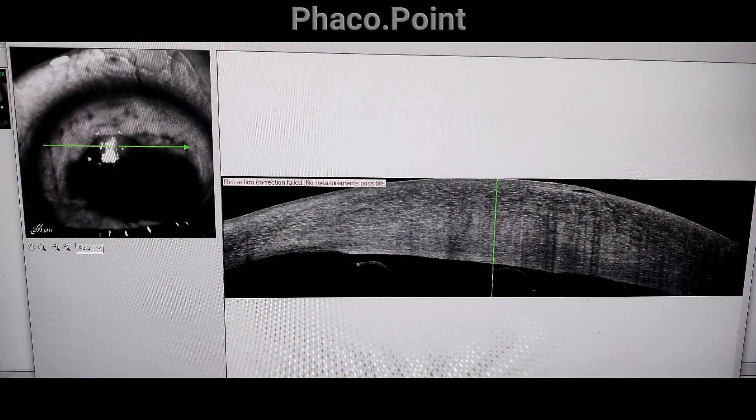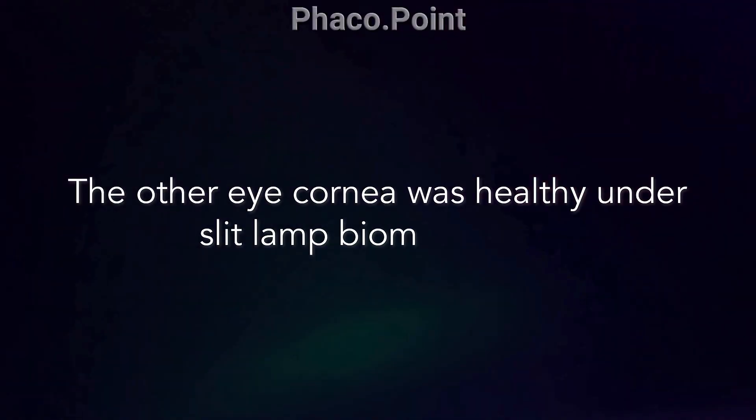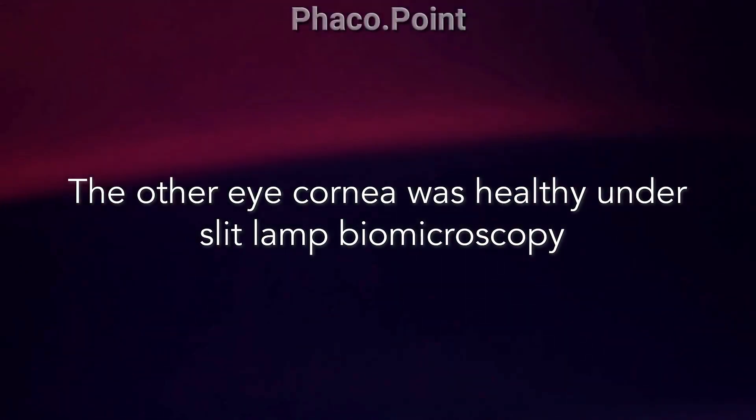On performing an ASOCT, in an area corresponding to the corneal opacification, there was a Descemet's detachment. It is to be noted that when we examined the other eye, the cornea in the other eye was completely normal.